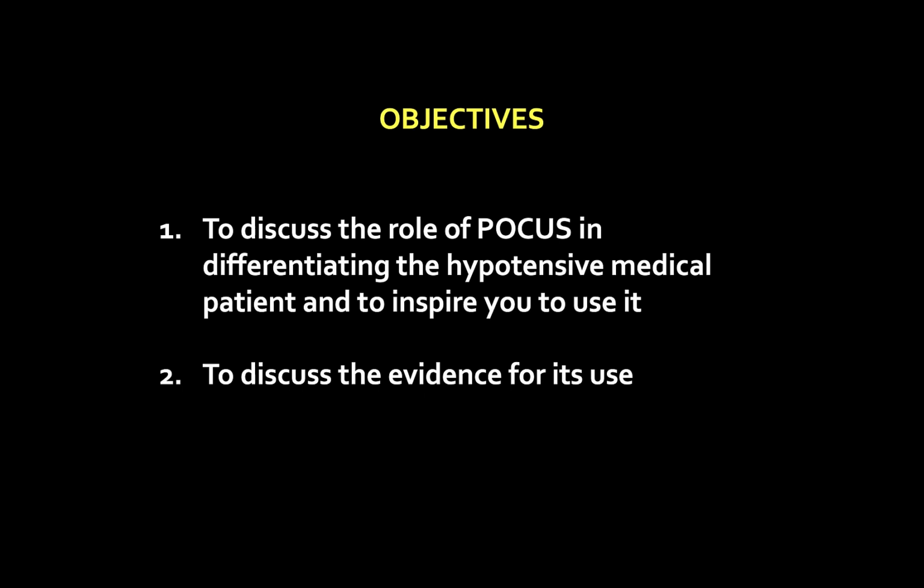One disclaimer: this tutorial was not designed to discuss the technical aspects of image acquisition. This tutorial assumes you have acquired the basics of cardiac, thoracic, abdominal, and aortic ultrasound. I refer you to other resources for help with acquiring and interpreting these images.